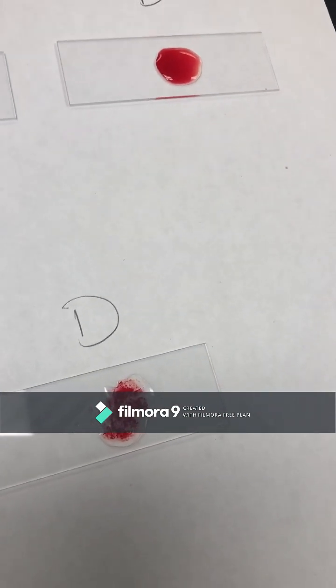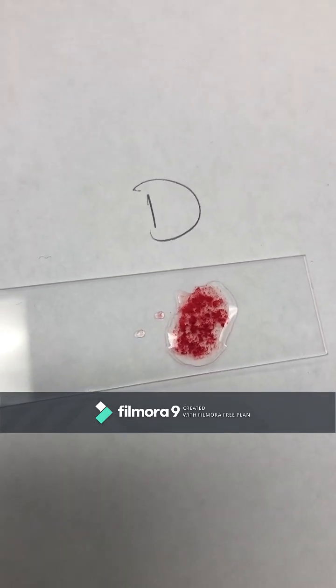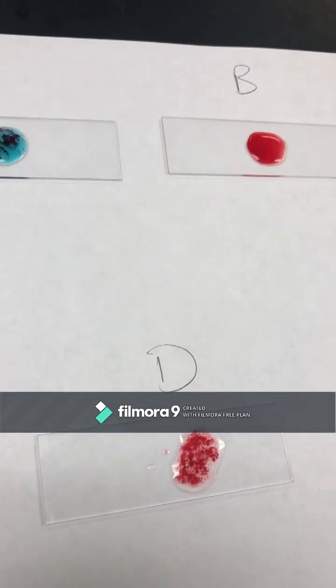No clumping on B — we're the same. And then A positive, right? Yes. So what's your blood type? A. What's your RH? Positive. So you are A positive. Good for you.